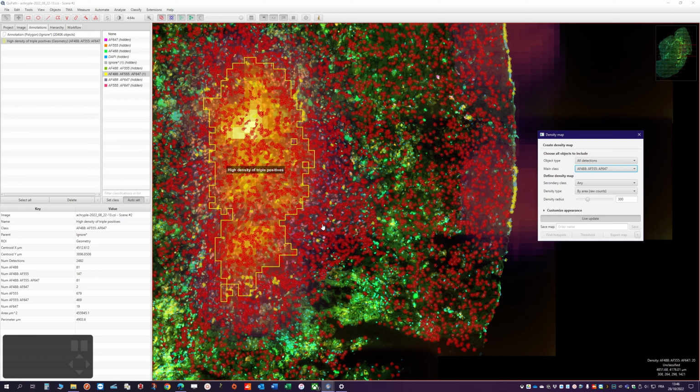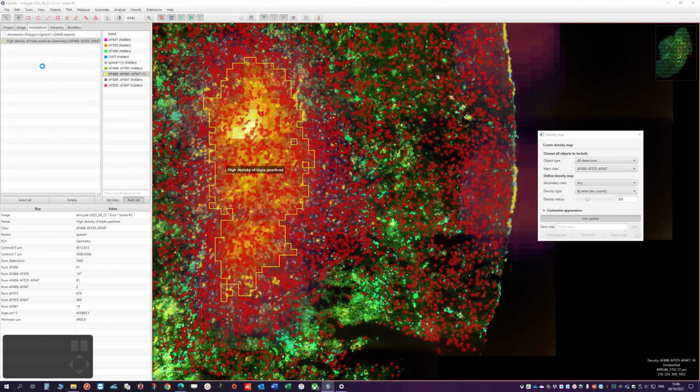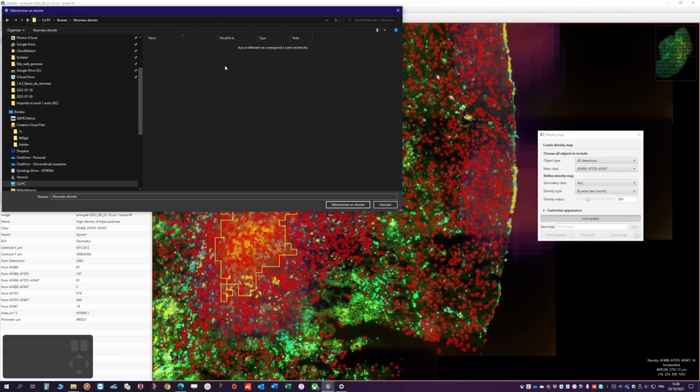So without further ado, let's start over with a new project. As usual, you create a project by creating a folder. So let's just put this on the desktop and quickly create a new folder. And let's call this new folder.